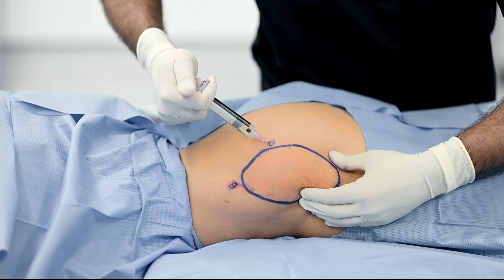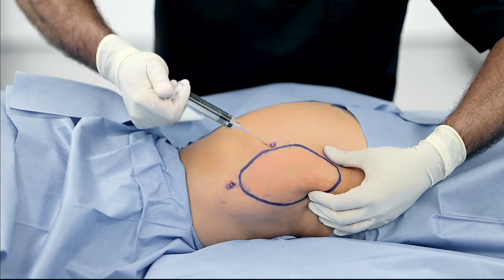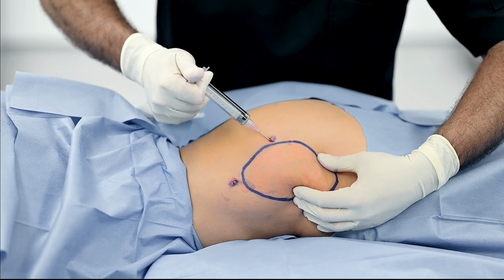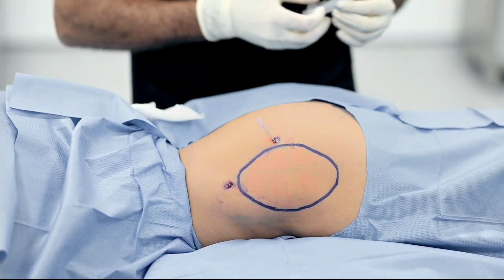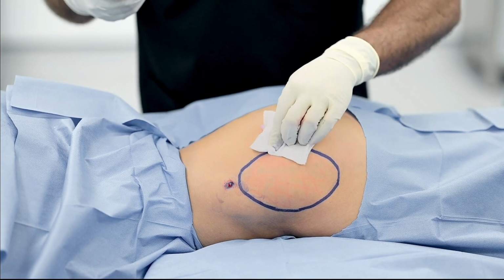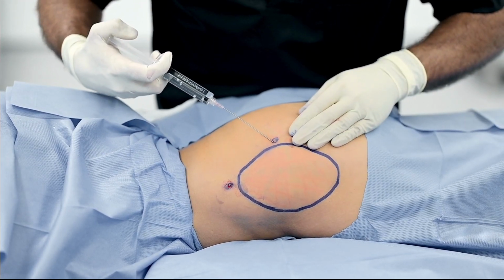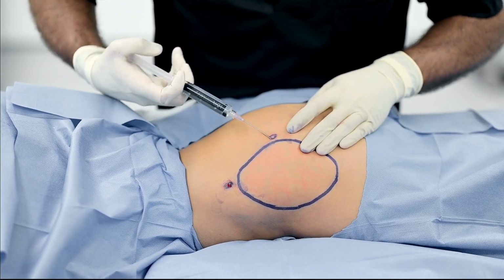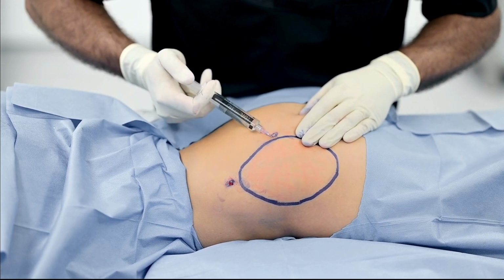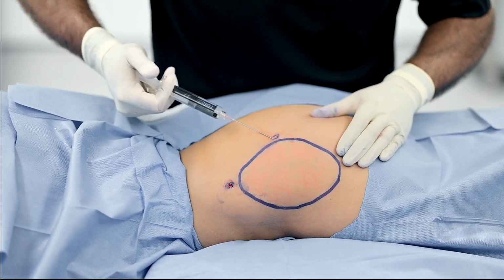And then we go a little bit more superficial now by not pinching but stretching the skin. So I'm more parallel to the skin surface. Not really subdermal, like a few millimeters underneath the skin. Okay, I will take another one, a fourth syringe.